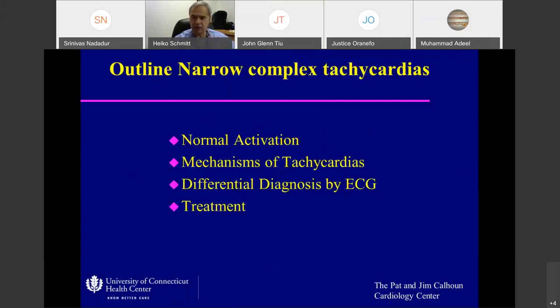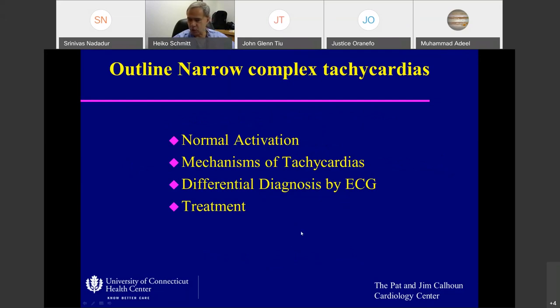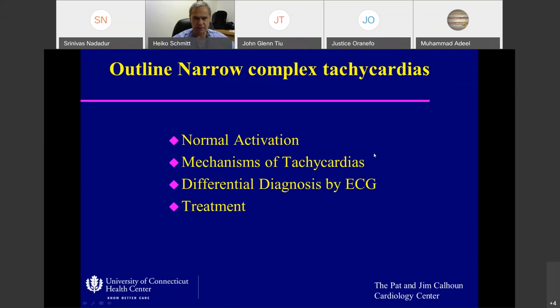Okay, narrow complex tachycardia. We go a little bit over the normal activation, we talk about the mechanism of tachycardia, differential diagnosis by the ECG, and then we go a little bit over treatment. I'll dip a little bit into the EP world with the treatment, but it will be very superficial.